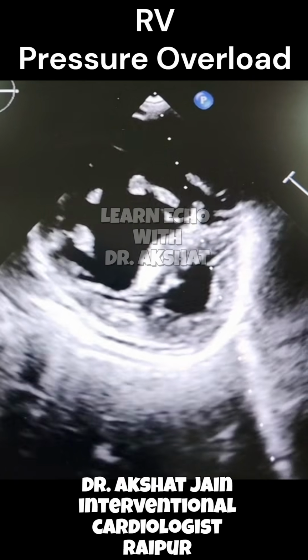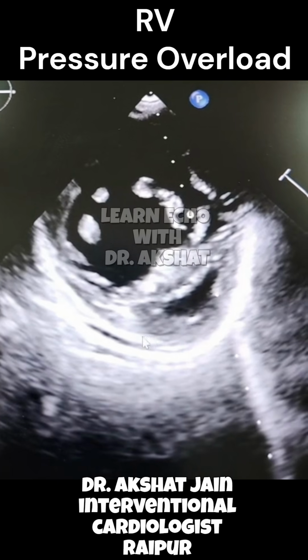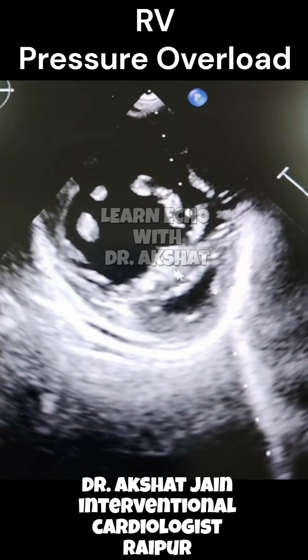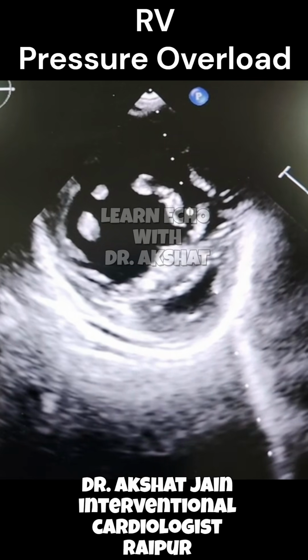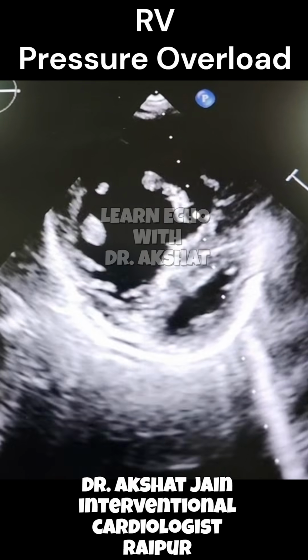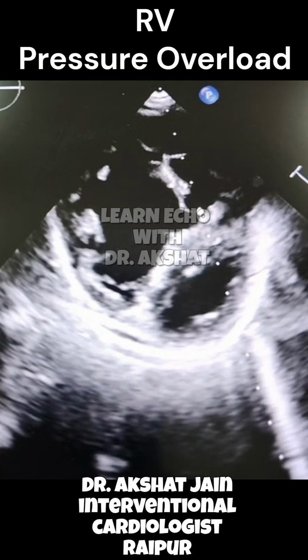So this is diastole. Now as we see, the systole is happening and these other segments are contracting. The interventricular septum is getting pressed by the RV into the LV. So this is due to pressure overload of the right ventricle. So in this case, there is raised right ventricular pressure.